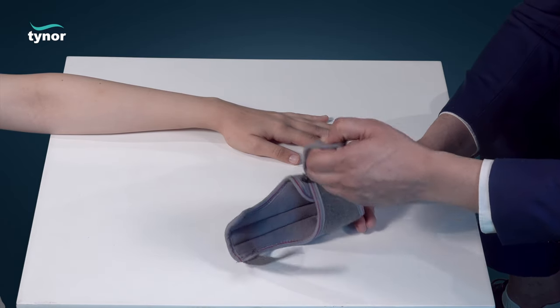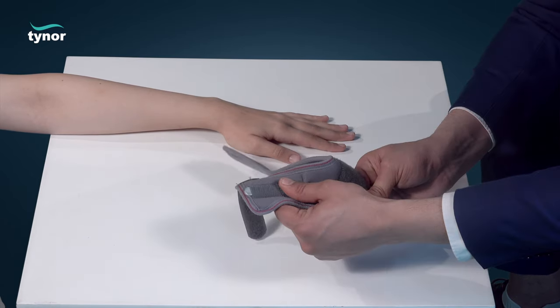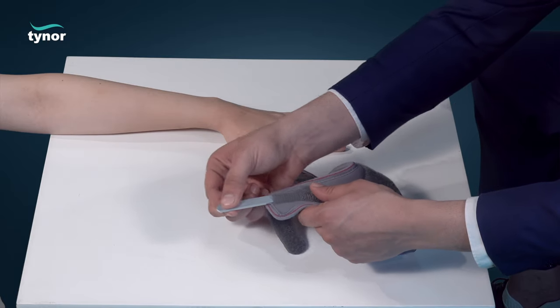Unfasten the fasteners. Push out the aluminum strip.